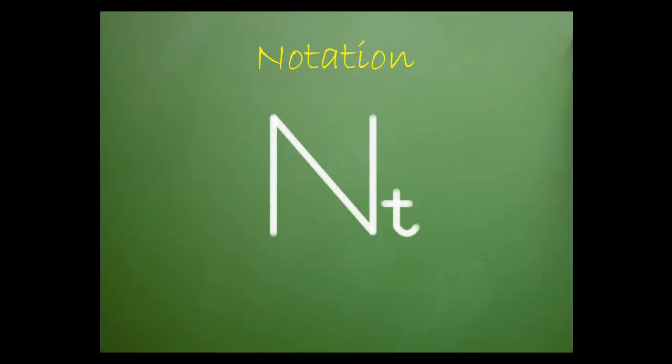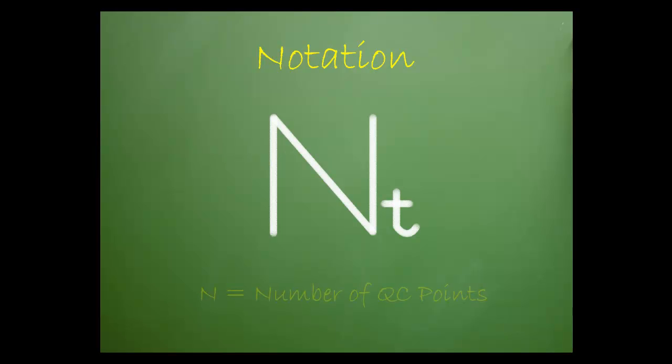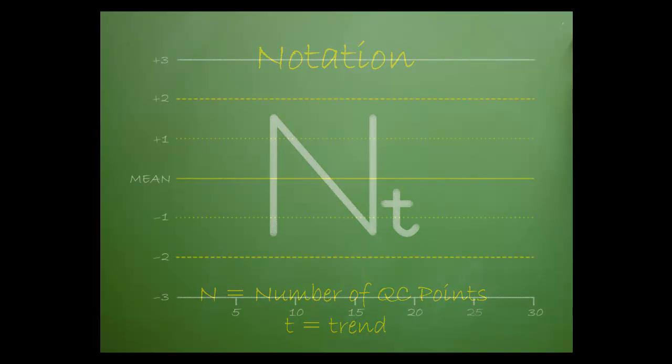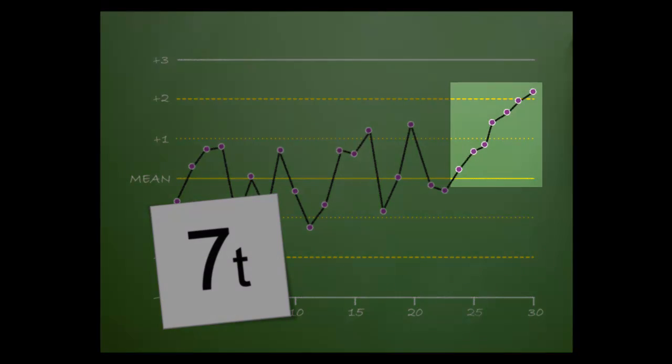An additional rule notation is NT. N is equal to the number of QC data points. T represents the consecutive data points for a single level of control that shows either a strict increasing or decreasing pattern. In this case there are seven consecutive points increasing on the same side of the mean.